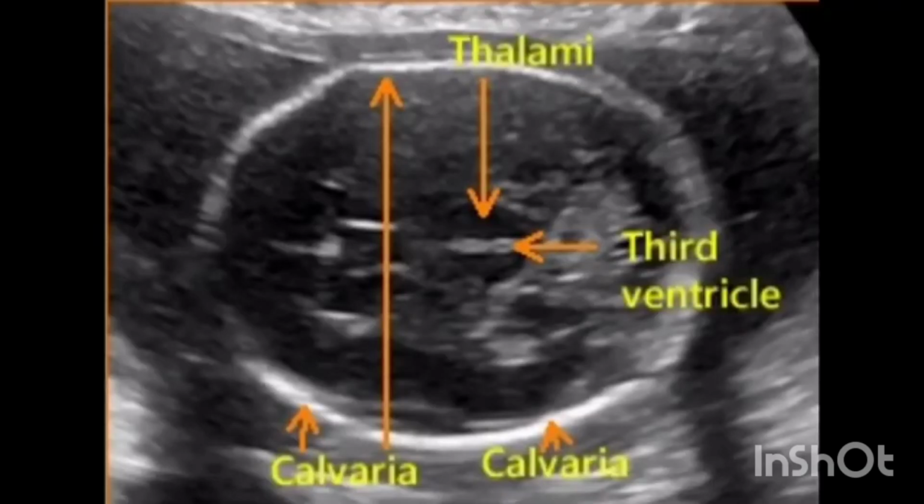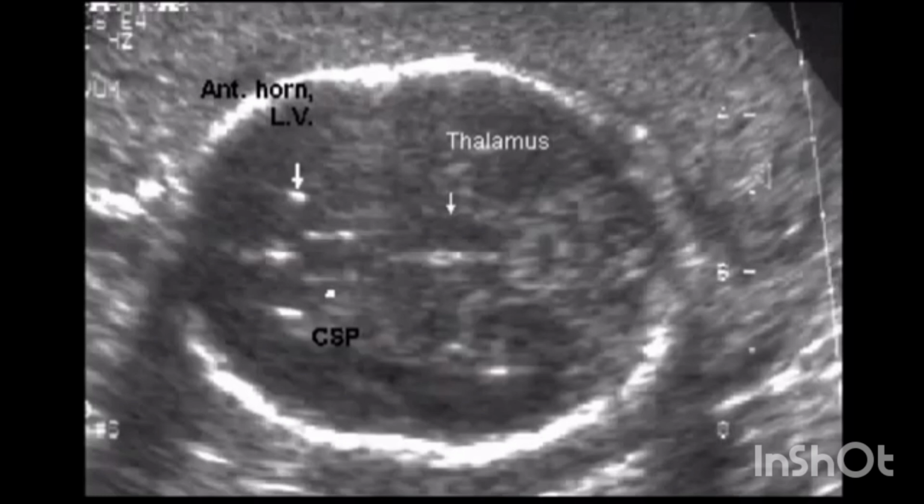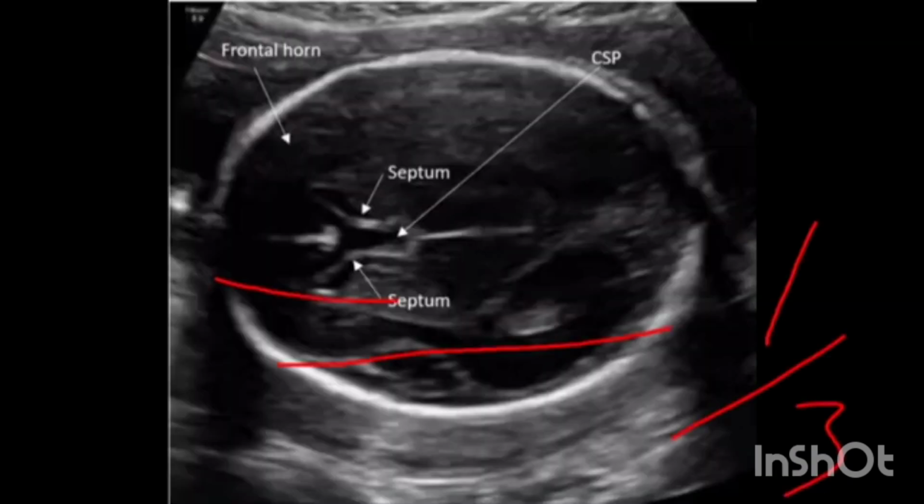The anatomical landmarks used to ensure the accuracy and reproducibility of the measurement include 1. A midline falx. The falx cerebri is a large, sickle-shaped infolding of the inner meningeal layer of the dura mater and lies in the midline of the skull. 2. The thalami symmetrically positioned on either side of the falx. 3. Visualization of the septum pellucidum at 1/3 the front occipital distance.